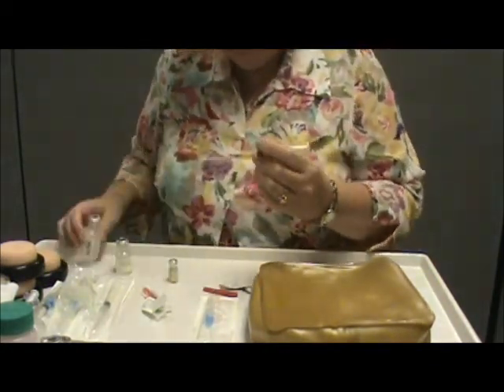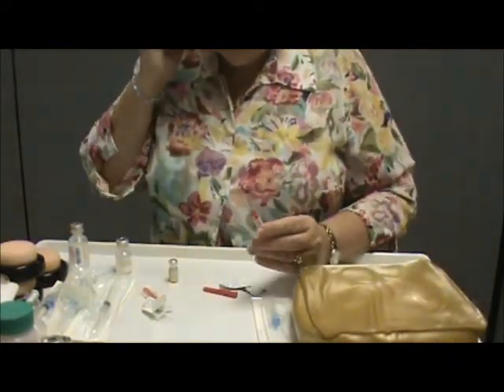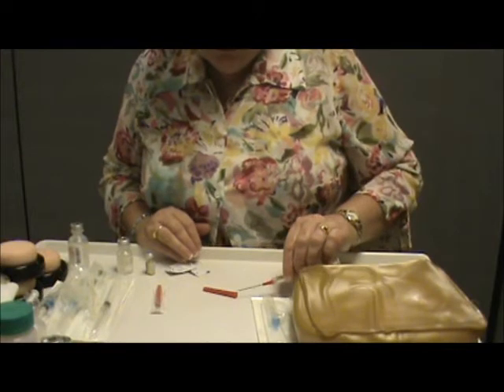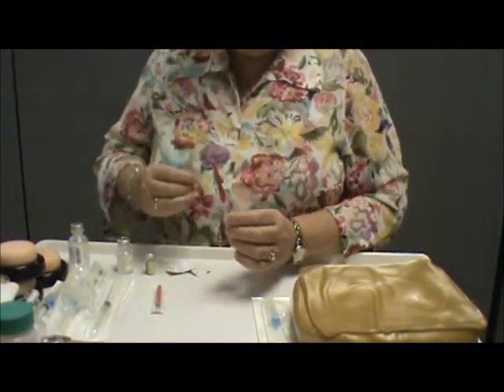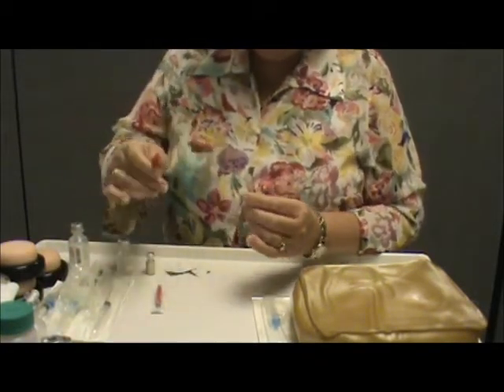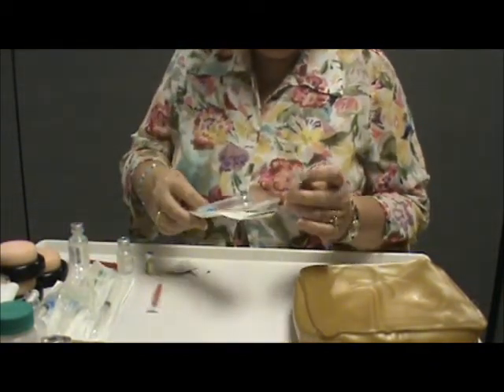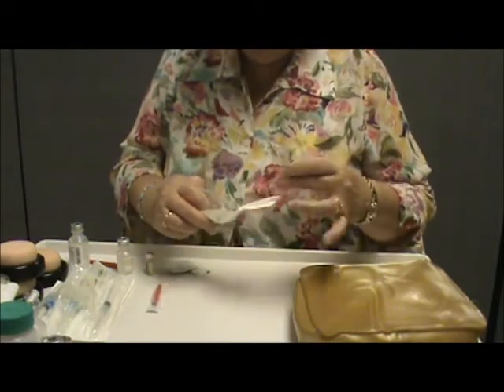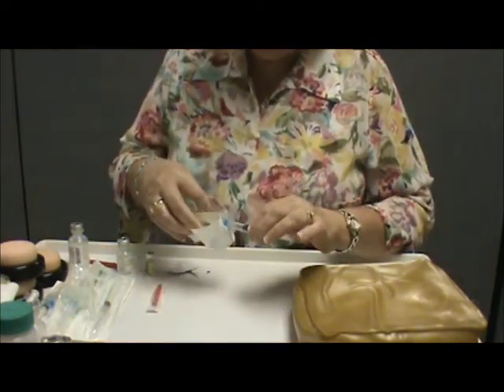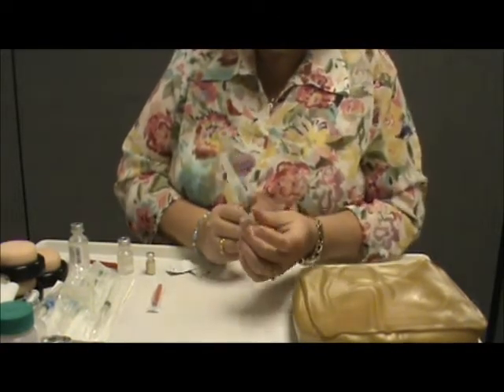Then I'm ready to change my needle. We always want to avoid recapping in any instance possible, but in some instances you will need to. You want to use this scoop and swoop method, so it's basically a one-handed deal. Then I'm going to remove this, drop this in the sharps, and then reapply my sharp needle. Screw it on tightly so that it's not going to leak when you go to inject your medication at the patient's bedside.